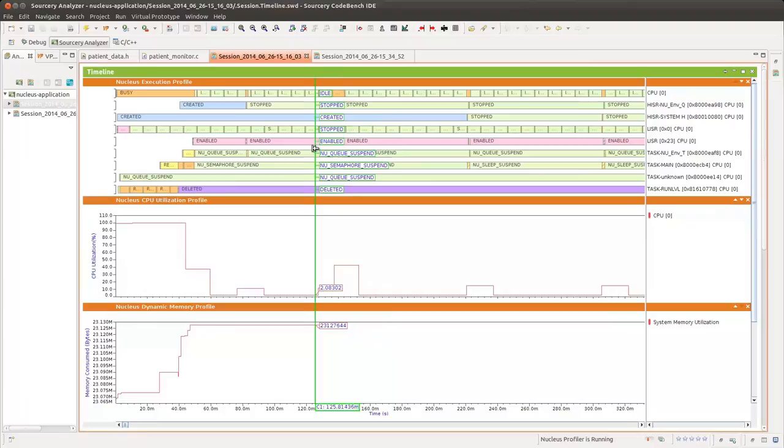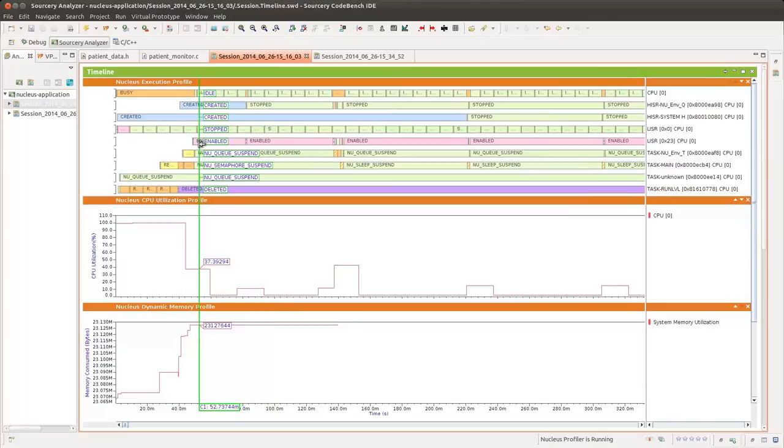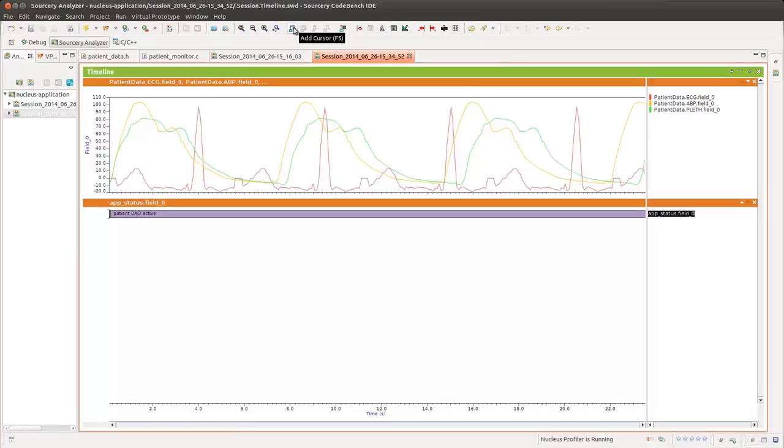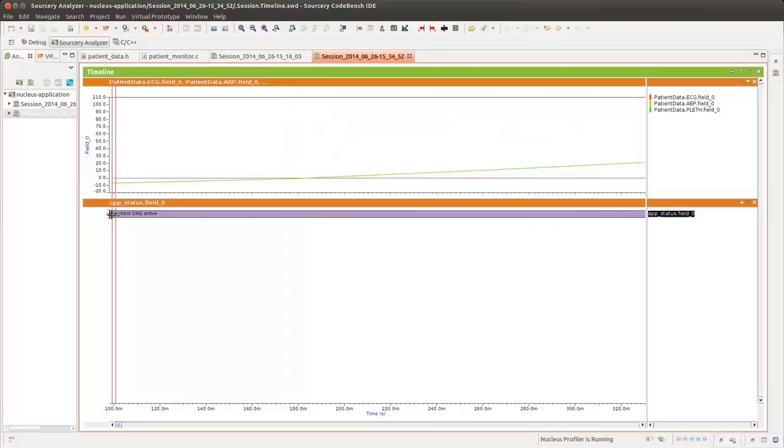The status of every interrupt service routine and task, as well as CPU utilization and memory utilization over time, are shown in this profile session. We've previously instrumented our application with a few simple function calls to produce trace data showing the values of key variables, which are then rendered by Sorcery Analyzer. The top waveforms show the value over time of each patient data field collected by the application. The bottom waveform shows the state of the application as either actively acquiring data or communicating.